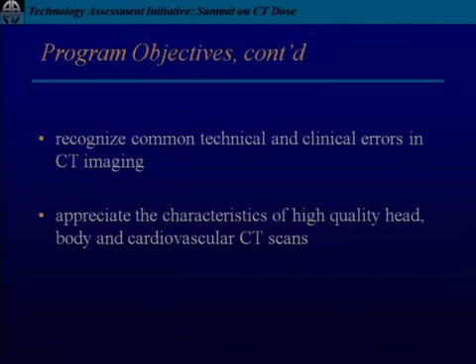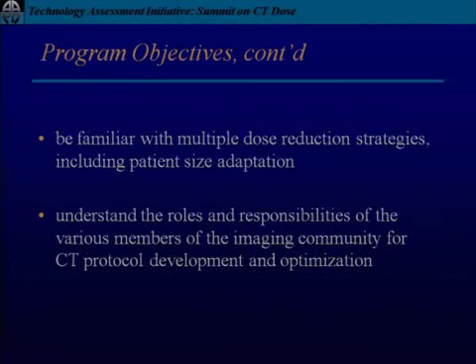You were comparing the GE versus the Siemens dual energy capabilities, and you alluded to differences in kV, of course, but the dual source Siemens could do different mAs. I believe that it's true that the GE scanner can't do different mAs, but they can pulse modulate and do different times, so they can deliver a different dose to the 80 kV than the 140, and therefore get the same effect. The overall dose, and this is just my practical experience, we have both scanners side by side and we're using them routinely. The dose on the dual energy heads coming from GE is a little bit higher, and we're not using it for that reason.